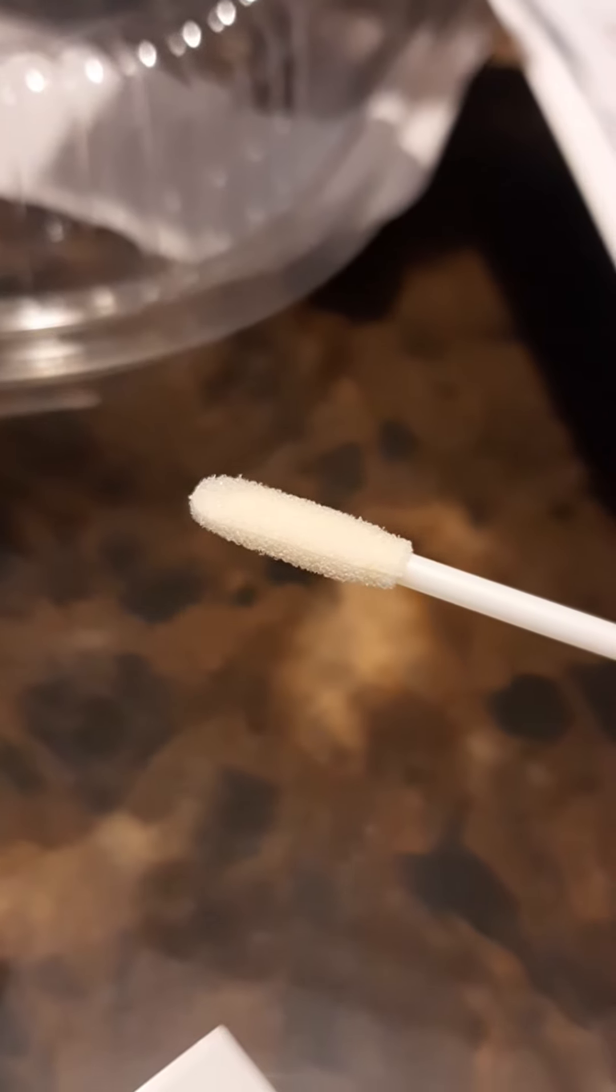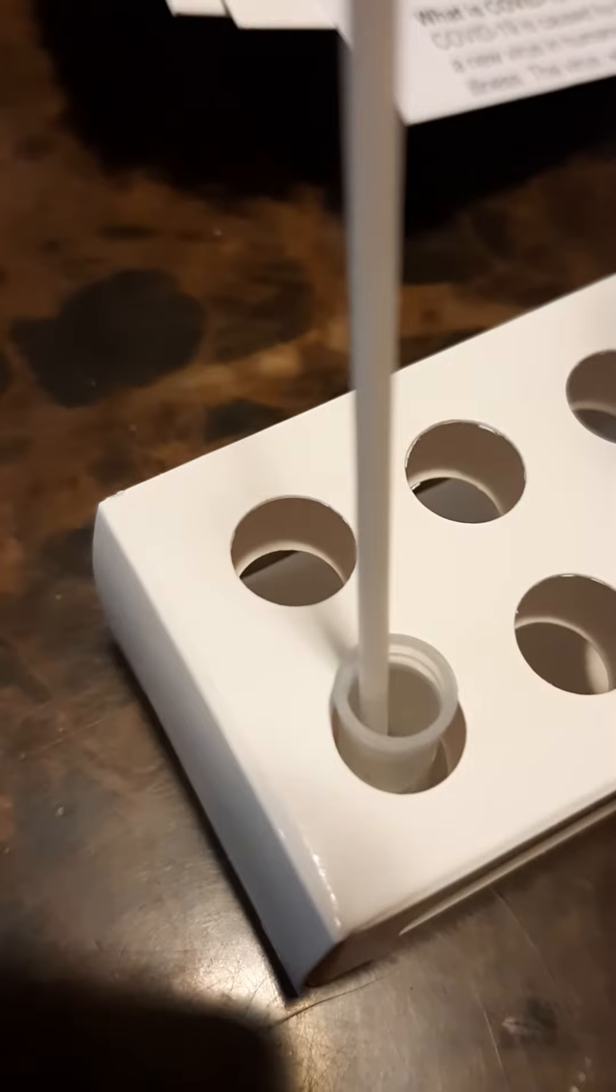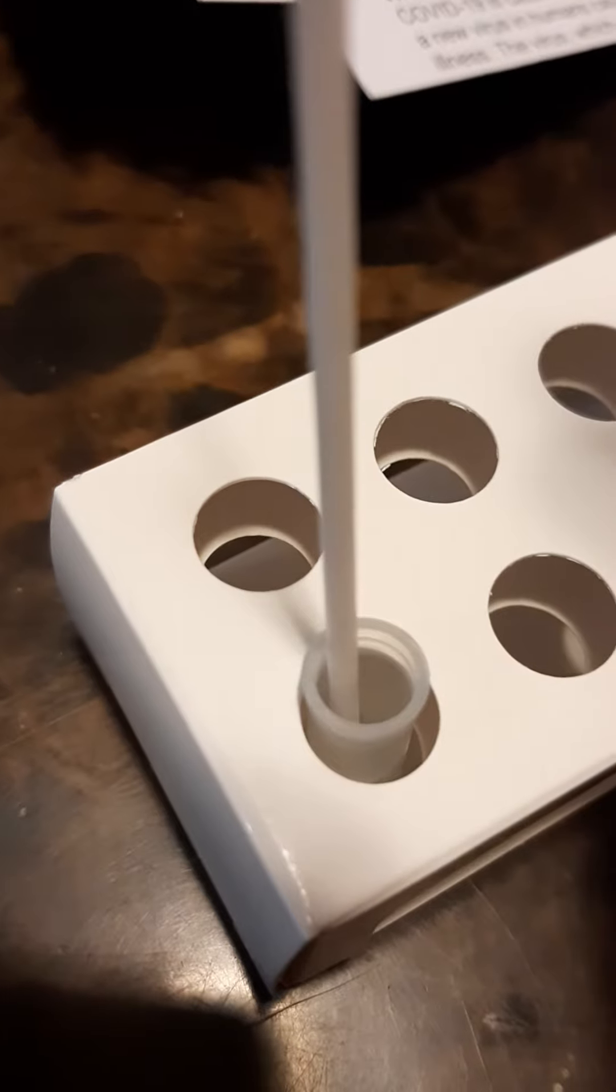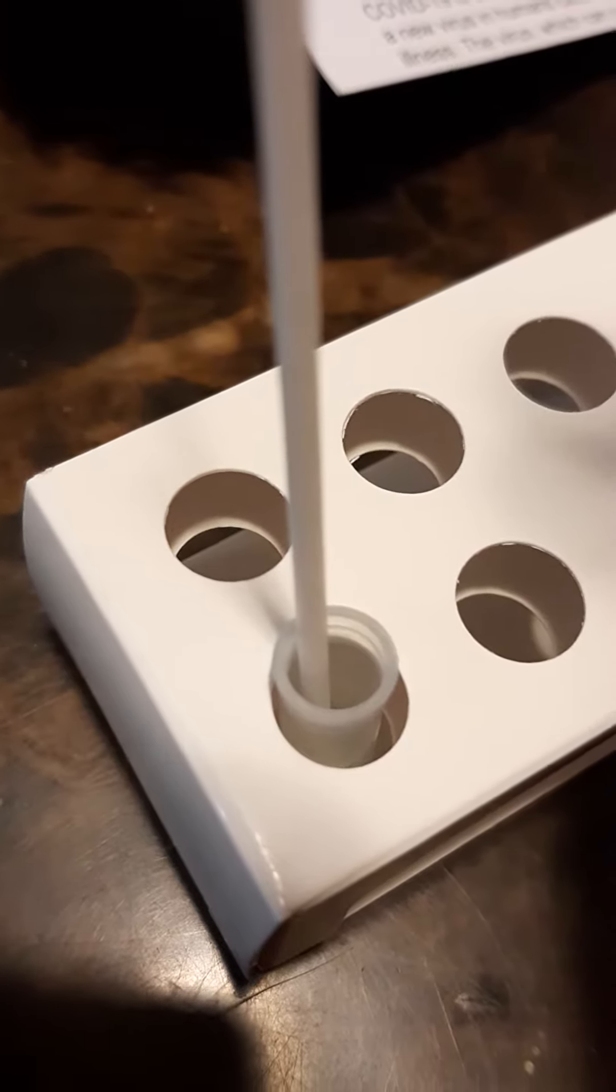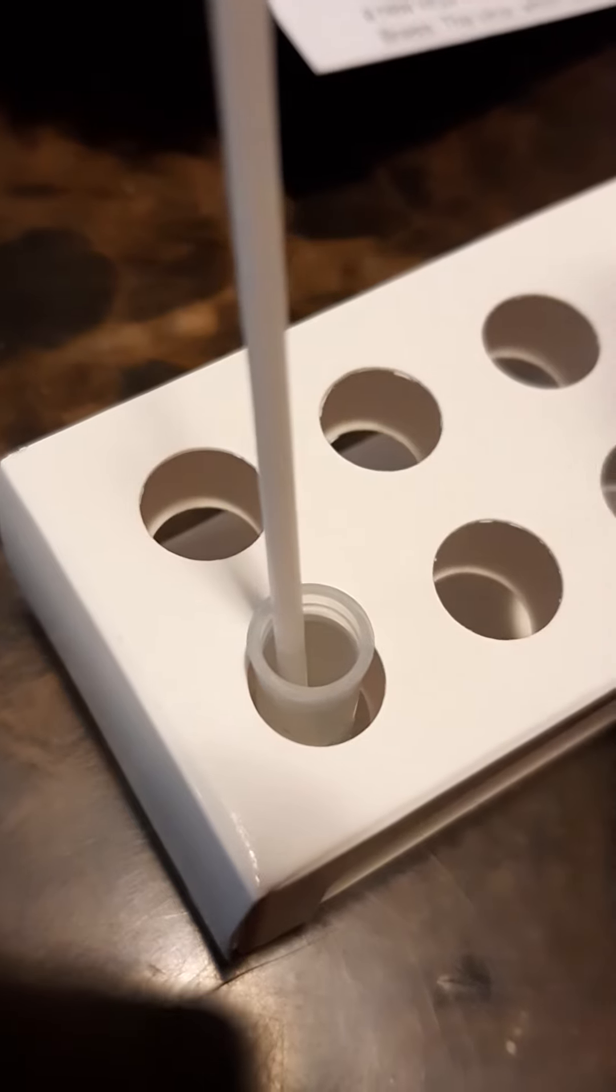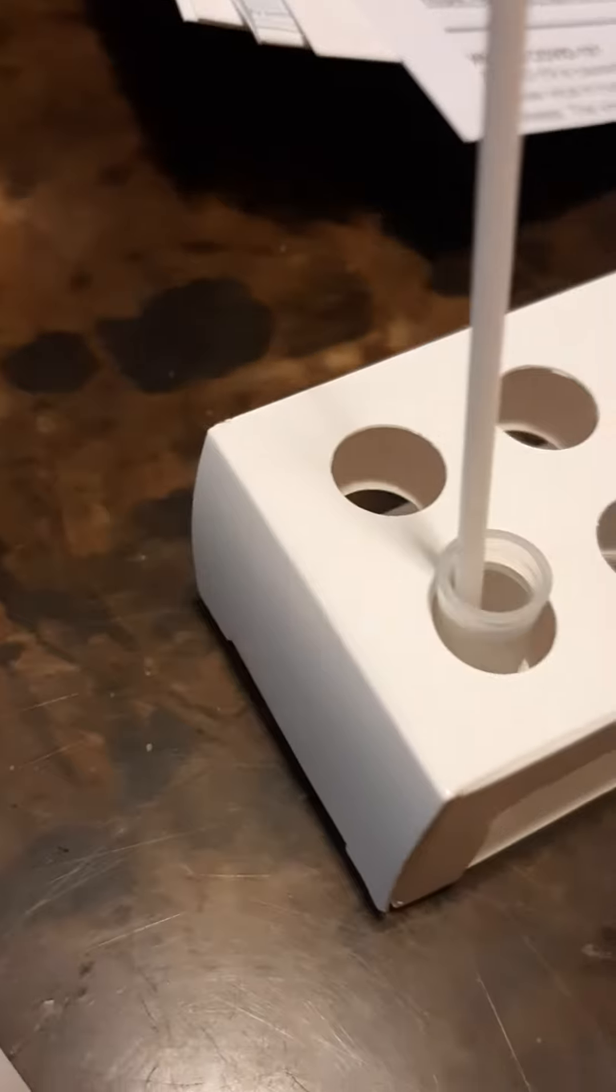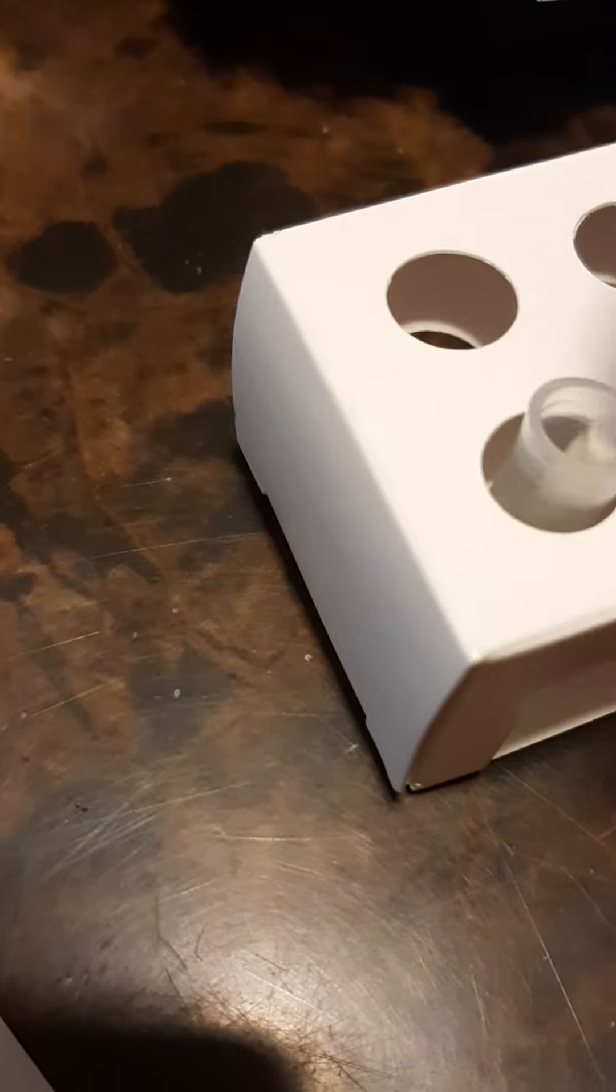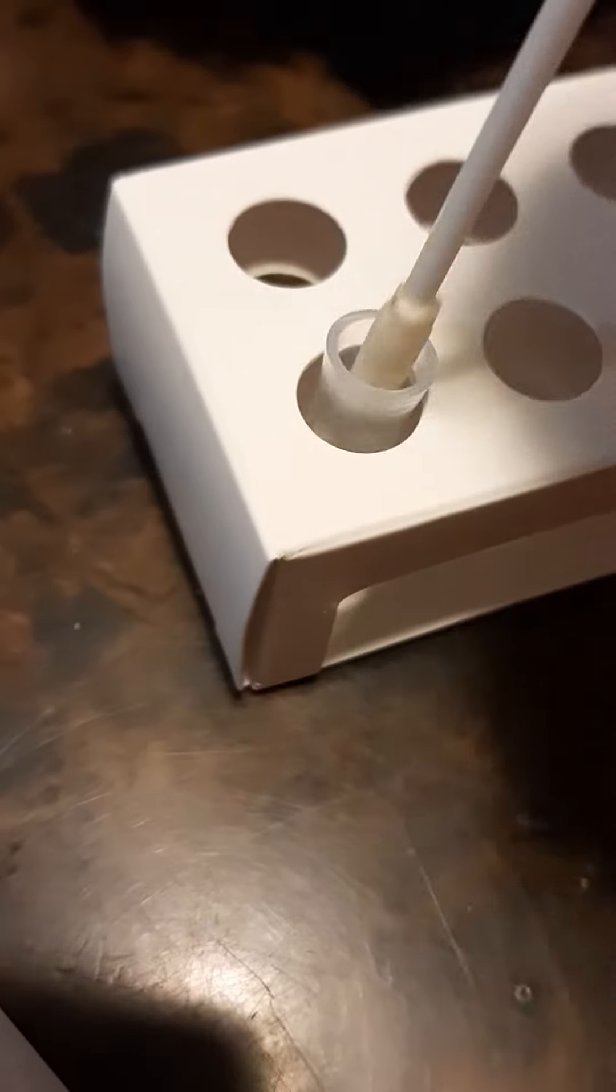Now the swab, so three to four times each nostril. Put this in three or four times. Leave it in for at least a minute. All right, take the swab out, try to get as much liquid off as possible.